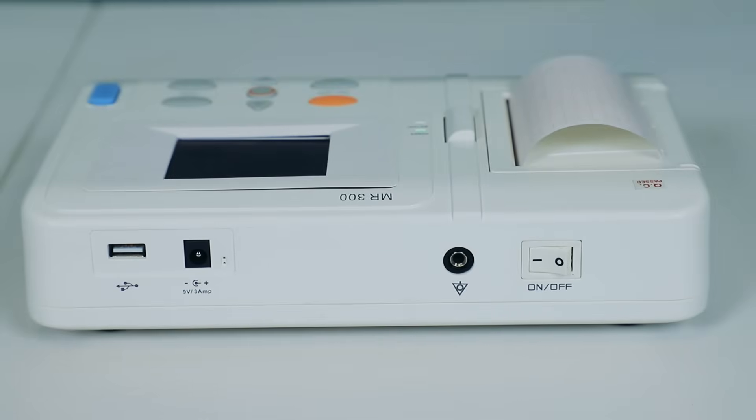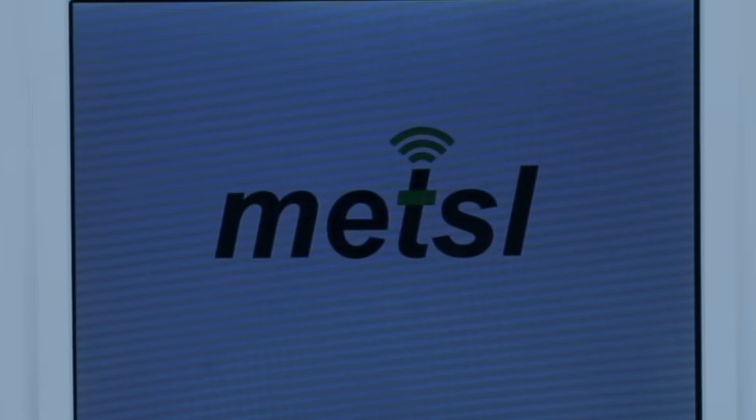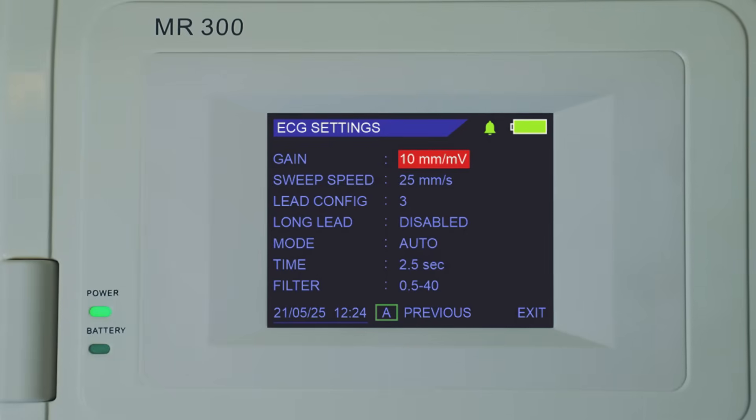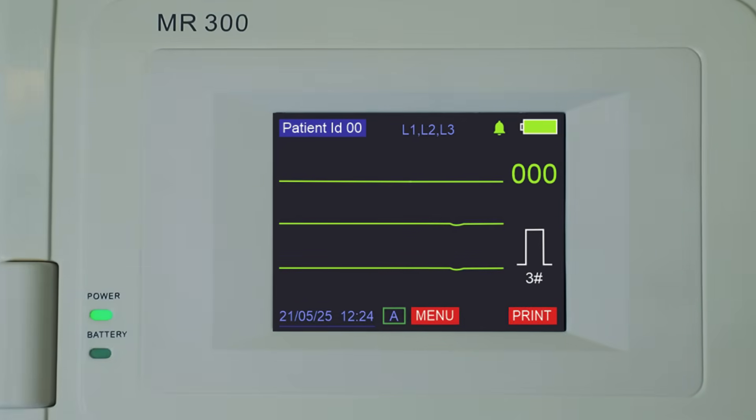Powering on is simple and quick. You'll first see the clear Metzl logo, transitioning smoothly to the main screen — your primary display area for all real-time ECG waveforms and patient data.